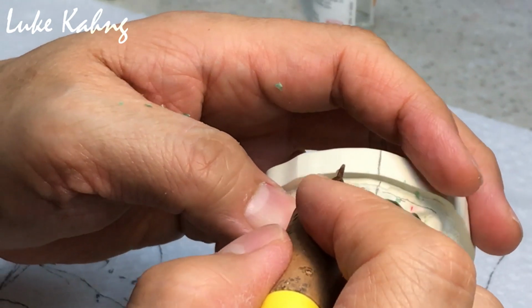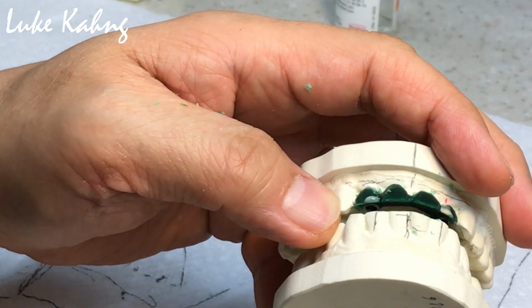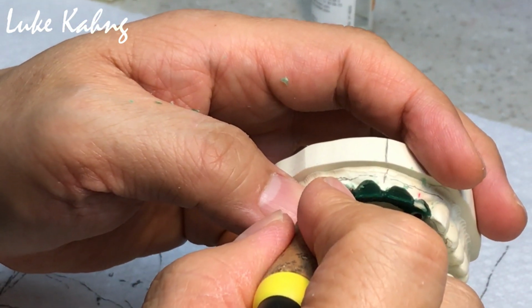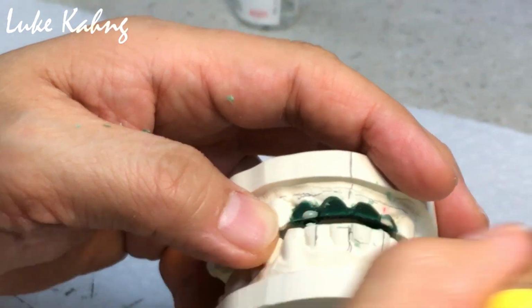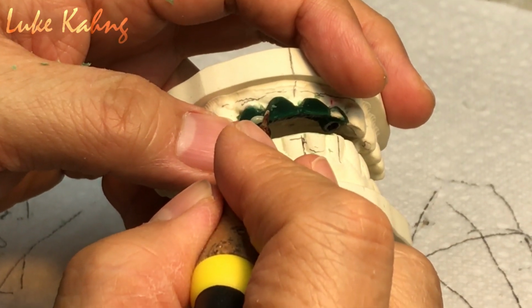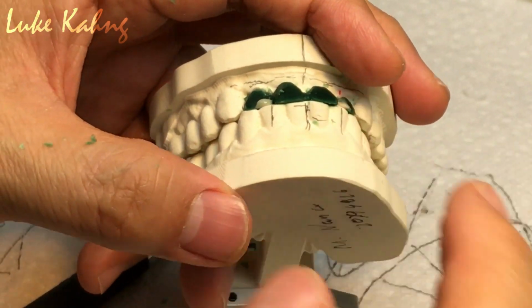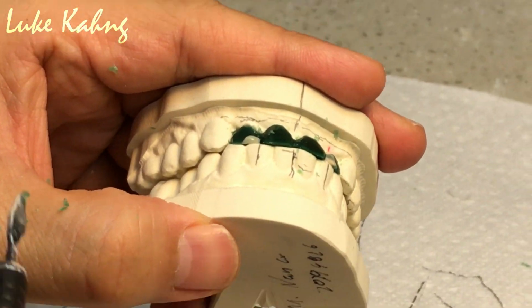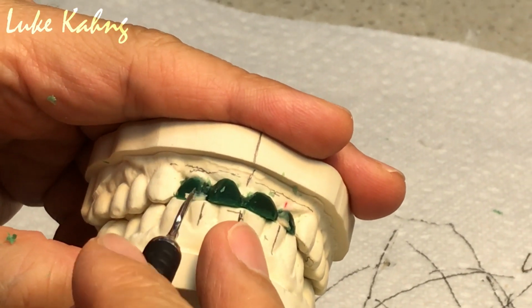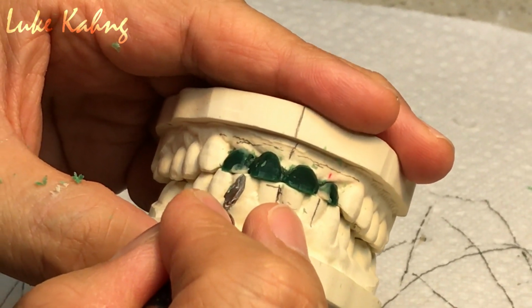Usually, and then I protect it. Here is the worst scenario. I'm going to talk to the doctor. Little trim here. Just a little tiny bit. But I have to give them support like that. Porcelain, so metal supporting. See? But too thick, so I can cut it. Just like that. But that one I need. Make sense? We can add a little bit more. Alright?